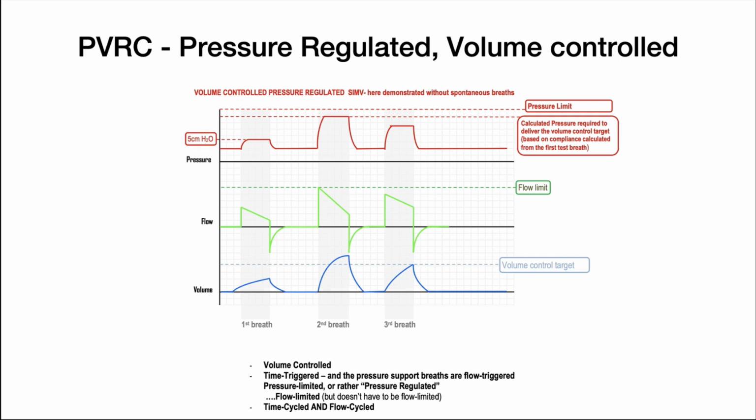PRVC can also be useful when a patient is not breathing spontaneously because it delivers a guaranteed tidal volume with a decelerating ramp inspiratory flow pattern, which minimises the peak inspiratory pressures generated. Many modern anaesthesia machines will have this particular flow mode on them, as well as the Hamilton T1. It is an option that's available on the Meduvent, but is currently switched off.